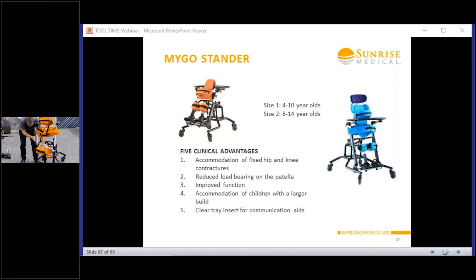Then you've got the flex on the knees, so it depends on when they're standing, if they've got that little bit of flex, so you're looking at that angle, or you're into accommodating stomachs and things like that as well. So it's just different shapes. It's going to allow for that little bit more. And you can take them out and spin them round so that you can put the knees at different positions as well. They don't have to be together. So you can change the angle on there, and then individually you can change the knees. And then you've also got rotation of the knees as well. So you can set one high, one low.